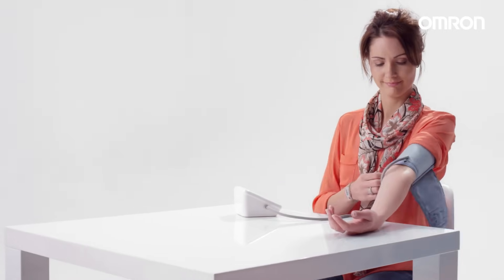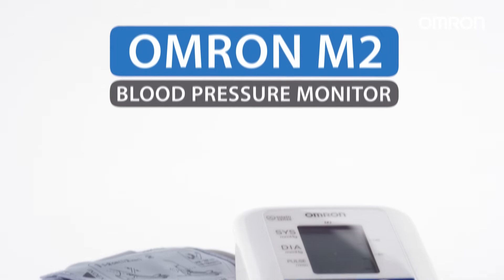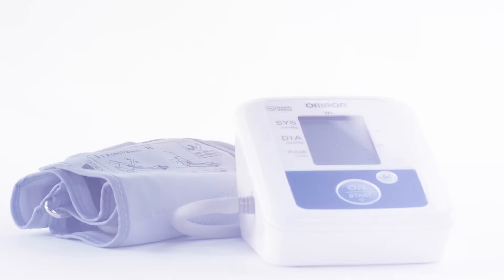Once complete, turn the machine off and remove the cuff. The OMRON M2 – blood pressure monitoring made simple.